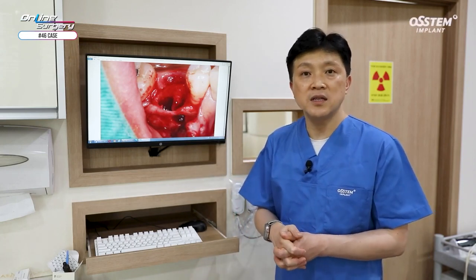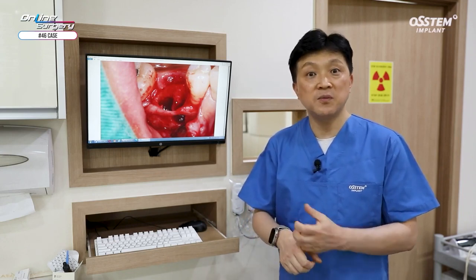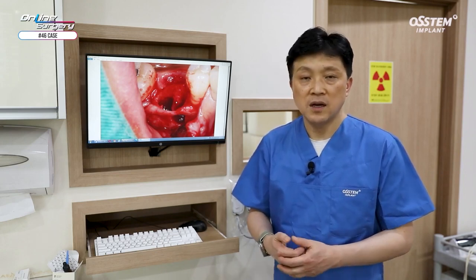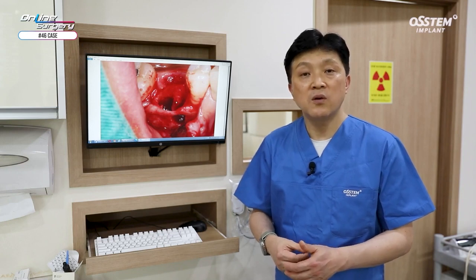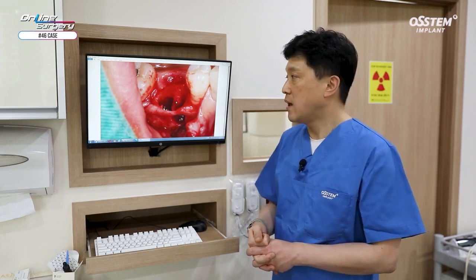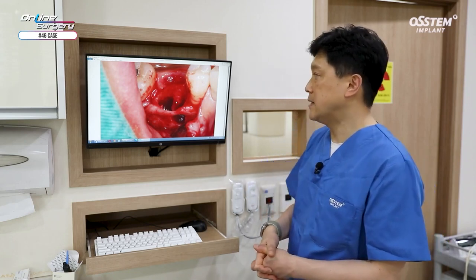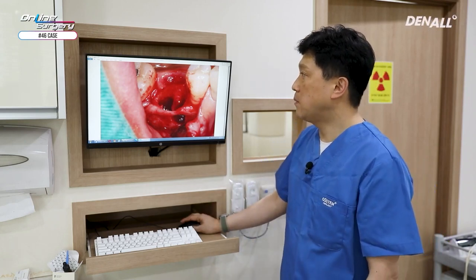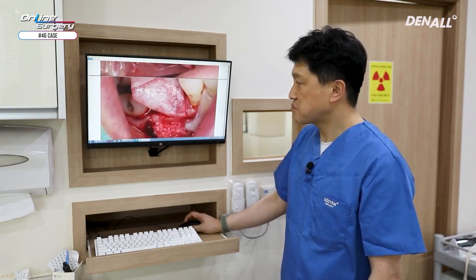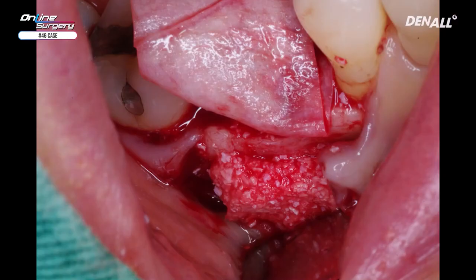There are many tools available that help us in this end, such as septum drilling kit or septum drills. You can use a diamond round burr, or you can use products specialized for this purpose. After this, you can use a lance drill or Linderman drill, and that'll be the safe way to do drilling. Implant was placed, and as shown, in order to address the buccal fenestration defect, bone grafting was done inside and outside the socket.